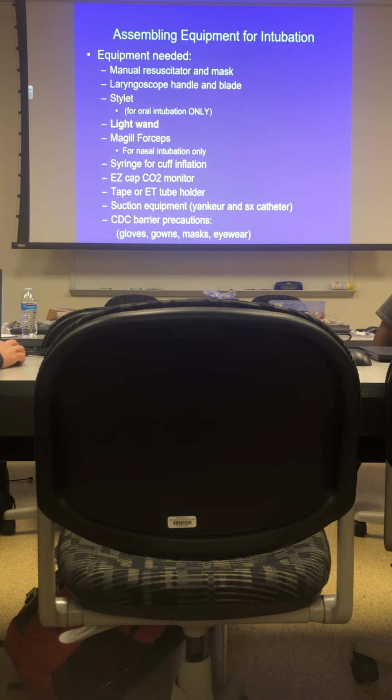This is all the equipment we talked about. So we used to use tape to tape our ET tubes, and we would use cloth tape. But then they came out with tube holders. All right, let me see if I can grab your tube holder. And those work really, really well.